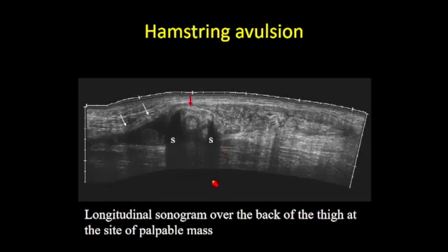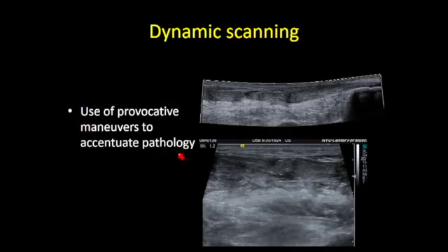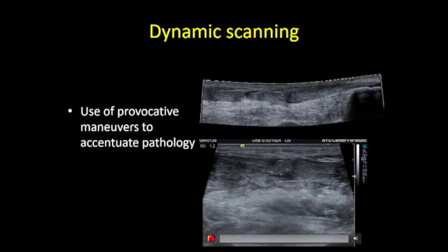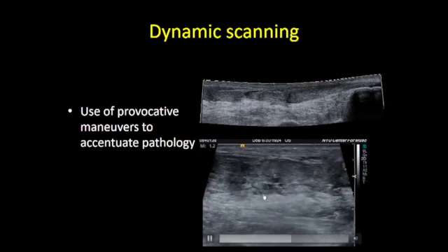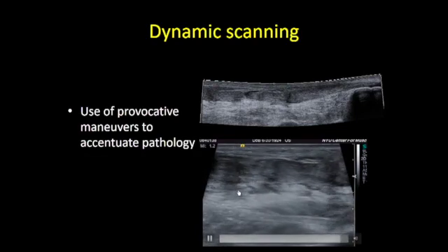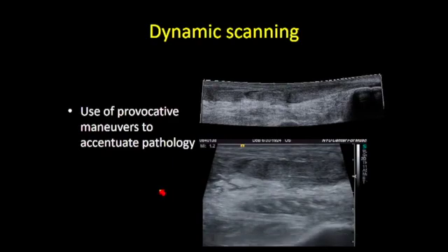We may not always identify the torn tendon directly, but a useful refraction artifact can help: because the acoustic properties of the tendon differ significantly from adjacent soft tissue, you see a dense refractile shadow on either side of the tendon end — as in this hamstring tendon rupture — precisely localizing it. Dynamic scanning using provocative maneuvers can also be very helpful. With plantar flexion of a diffusely abnormal Achilles tendon, you can see the gap open up and confirm the proximal portion is not moving, identifying a complete rupture where the torn ends are in close apposition at rest.